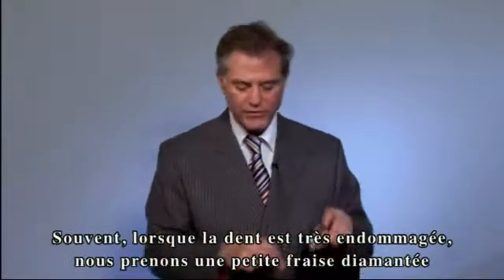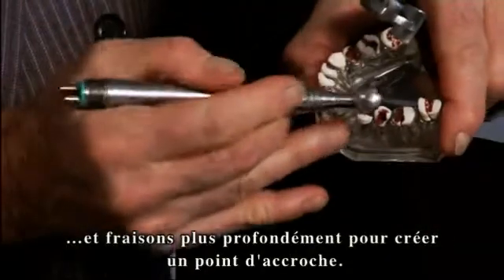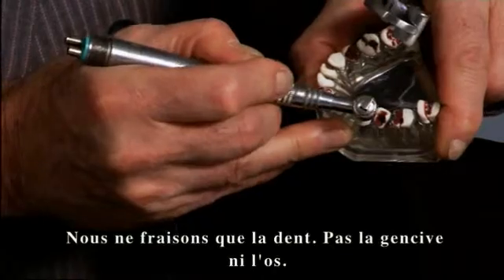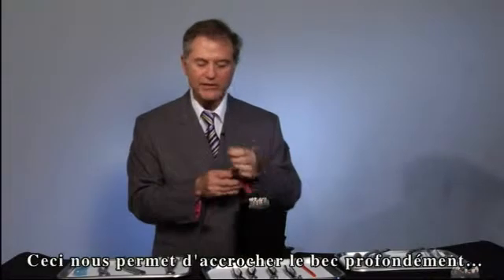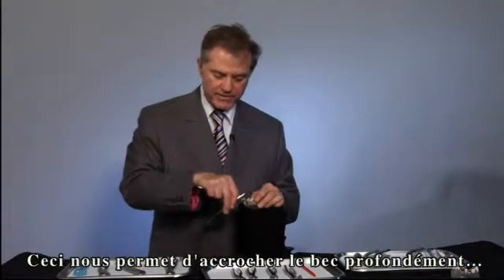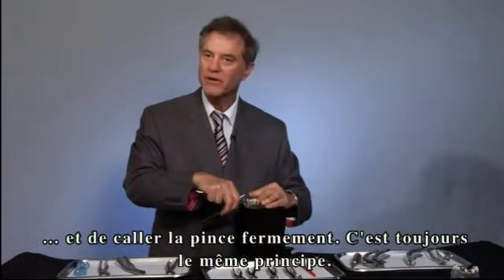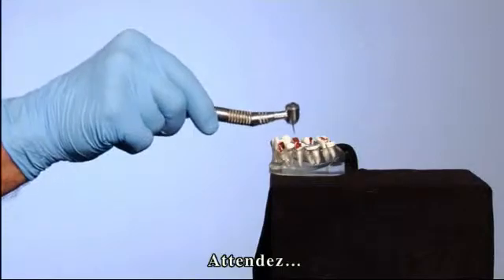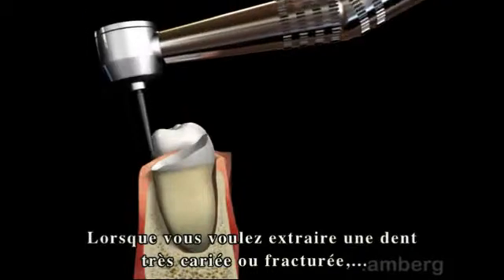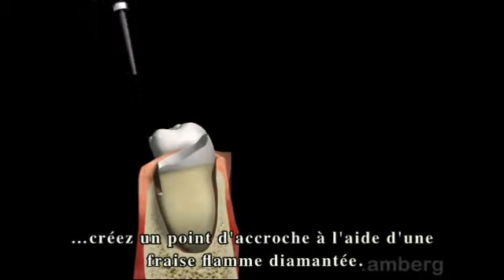Many times, if the tooth is completely rotted, what we do is take a little diamond and go farther down and create a purchase point. All we're doing is removing tooth surface only — not gum and not bone. This allows us to push the beak down a little farther and lock it on. When removing a severely decayed or broken down tooth, create a purchase point by using a flame-shaped diamond burr.